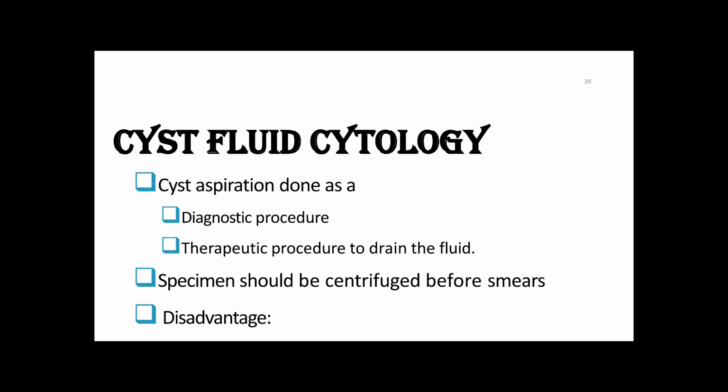So very carefully we have to examine these cyst fluids. Cyst aspiration is done as a diagnostic procedure and a therapeutic procedure to drain the fluid.